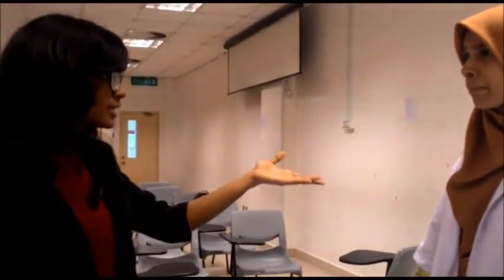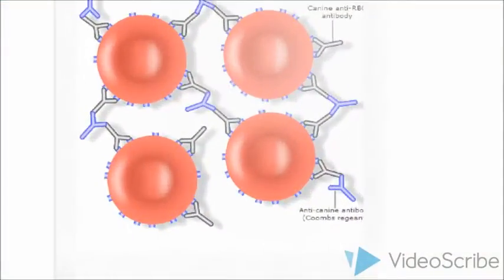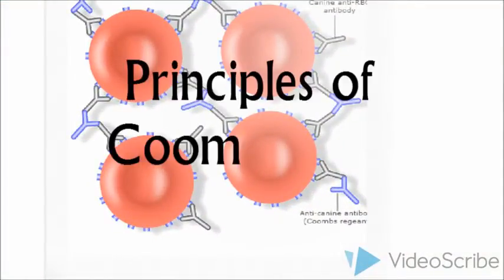Doctor, I still don't get what this Coombs test has got to do with blood transfusion. This girl is dying over here. I don't get why we have to do this. That's why you need to know the underlying principle behind the Coombs test. Let's watch. So, welcome back. Now we'll look at the principles of Coombs test.